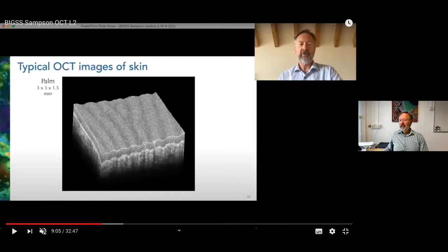Yeah, it looks like Aaron is putting that up. So the question from Atta in University of Twente, I think, is: in the 3D representation of OCT data, what do the darker areas refer to? Okay, that's almost what we were talking about. That's a logarithmic intensity scale. The bright regions represent higher scattering, the darker regions represent lower scattering. I apologize, there's no scale bar on it, but typically it would cover a 30 dB to 40 dB dynamic range.